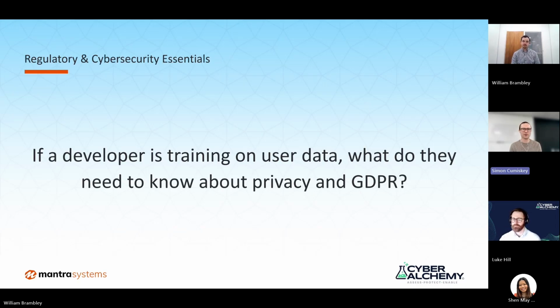So try and focus on what that unmet need is, and then understand the sort of data that you'd need to build a model that can address that need. And the big word is generalizability: making sure that for the model you train, you've got sufficient data that it can perform accurately, but also across a diverse patient population.